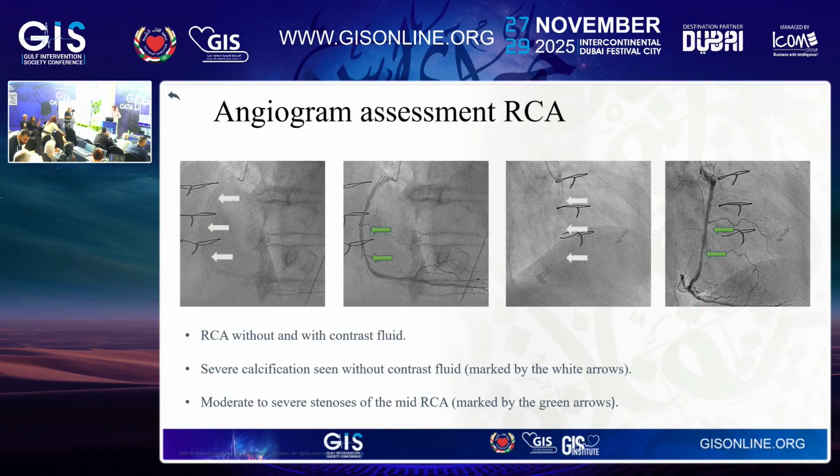So great. So if you look, he mentioned 3 important things in the post pathway. Yeah. So he already moved to the post PCI flow, which is things that we're going to discuss. But what about pre the PCI? Before we do the PCI, what's important information for you?